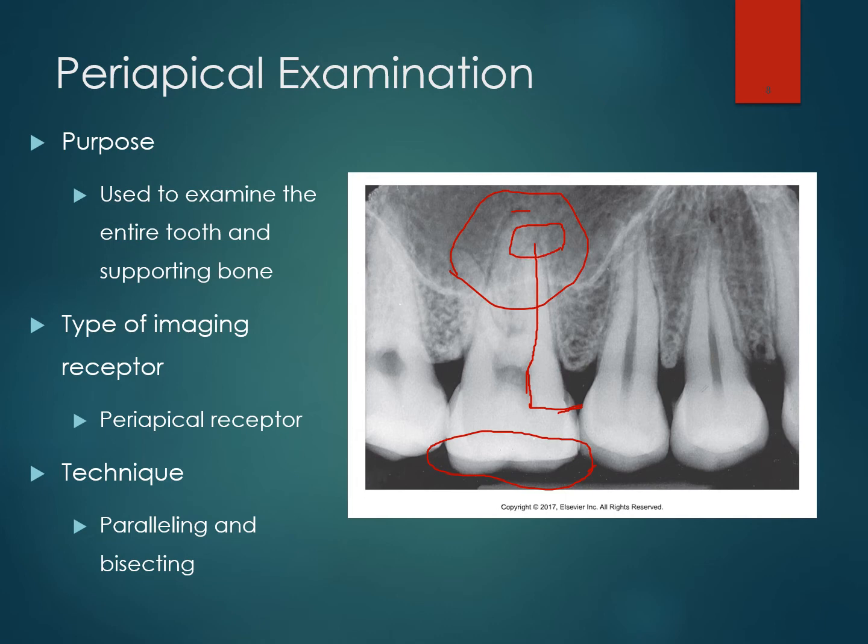If we had an infection, we would see a radiolucency or a darkness around the tip of this root. And that would mean that the cavity had traveled all the way through this enamel and dentin and had traveled into the nerve of the tooth and then traveled up. Infection always takes the route of least resistance, and so it's much easier for this infection to grow when it comes into this nerve canal and then just travels up the canal versus trying to burrow its way back out through the side of the tooth.